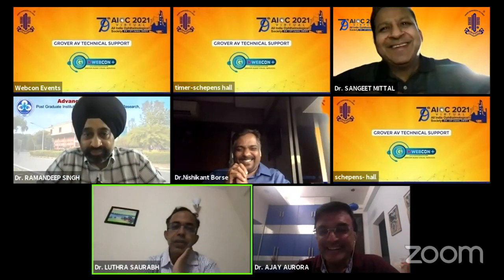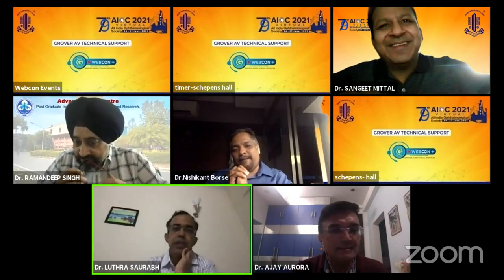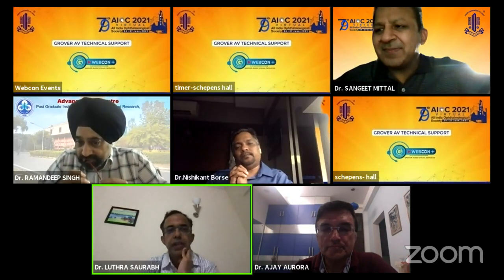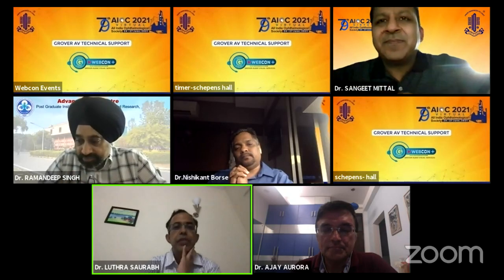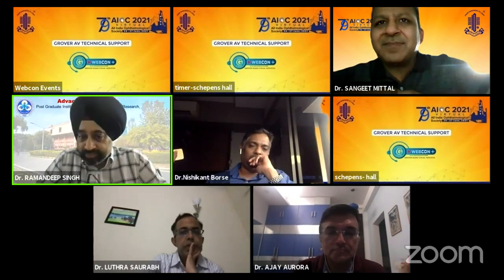Okay, got it. I had a question for Dr. Ramandeep: for the biopsy for lymphoma, can you use a 27 gauge system and, instead of making a retinotomy with the soft tip, just go in with a 27 gauge cutter and use that? The transretinal biopsy is very much possible with the 27 gauge, yes.